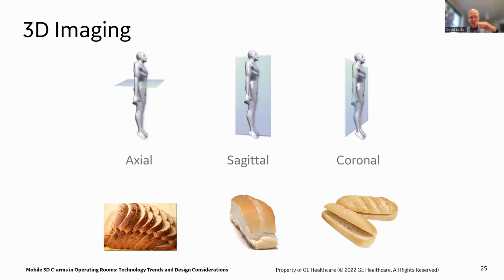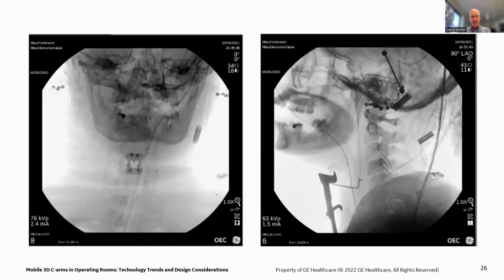And that axial shot is really magical and gives so much more information that you just can't get from a 2D when you need it. So let's go back again. I have these 2 orthogonal views, my very good 2D views, again, giving me a good way to start having my brain build a 3-dimensional picture of the skull and neck. But one thing I have a hard time doing with just these two pictures is knowing exactly how far the screws went into the neck.